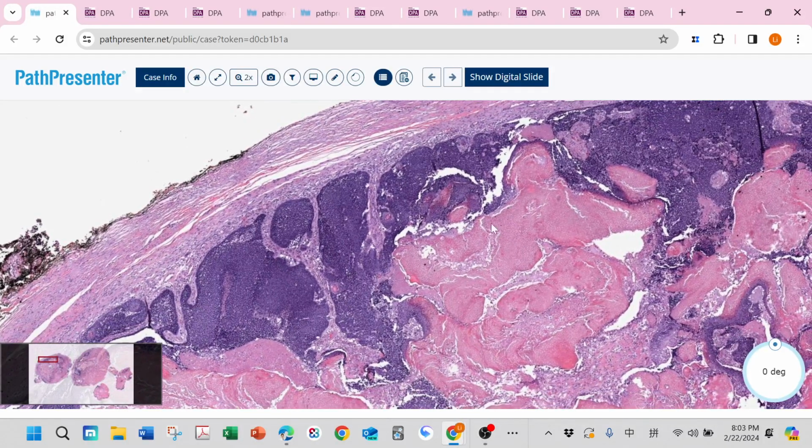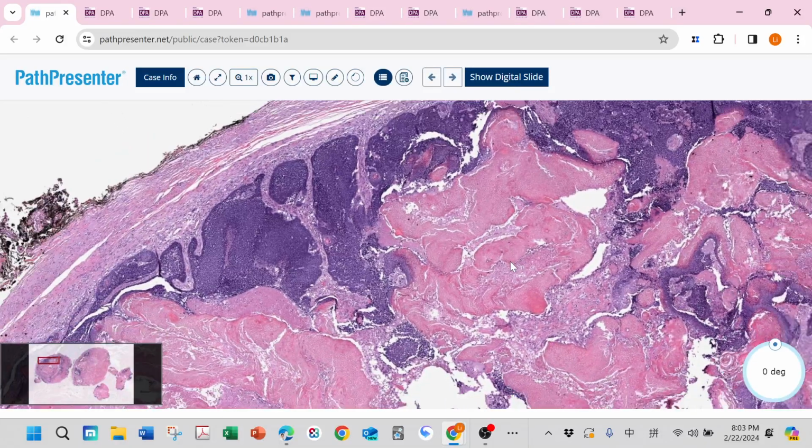And then there are some cells kind of ischemic, so-called necrosis, because these cells lose their nucleus. We call this ghost cell. So combine this basaloid cell, ghost cell.